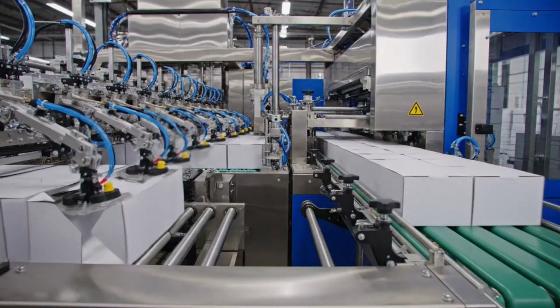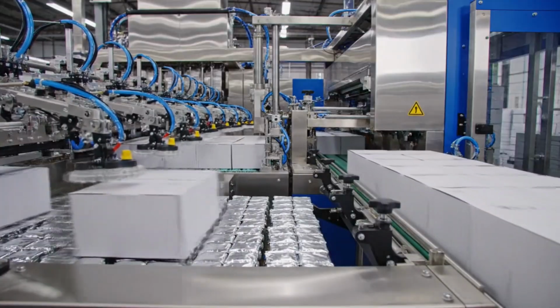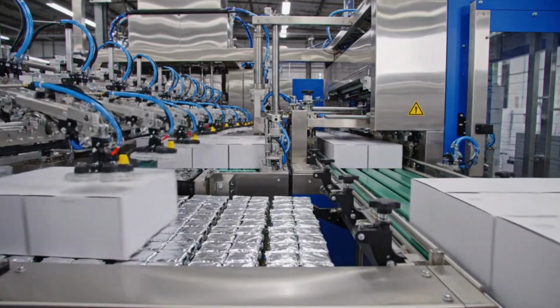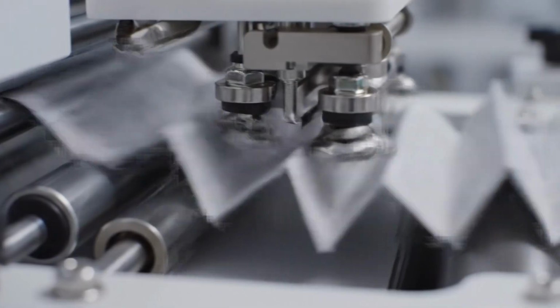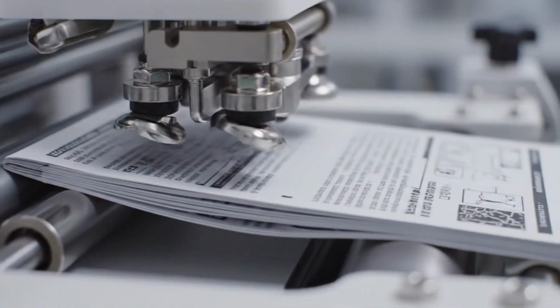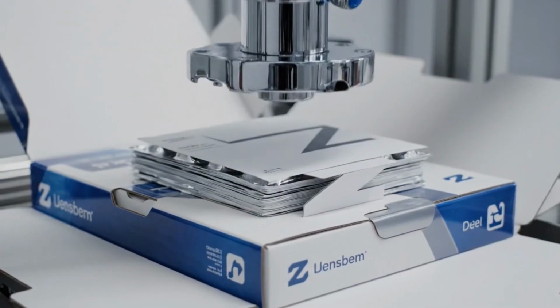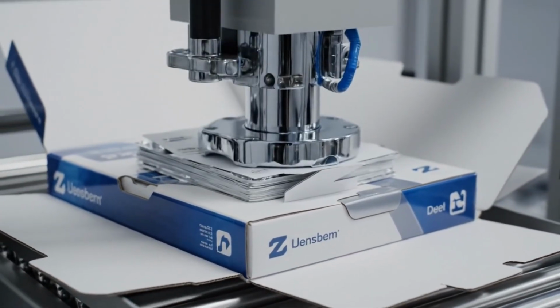Speed meets precision. This machine can process thousands of retail boxes an hour without a single fold out of place. Safety is our priority. Every box must contain clear, legally required instructions for correct and safe usage. The internal components are now securely housed in their branded shell.